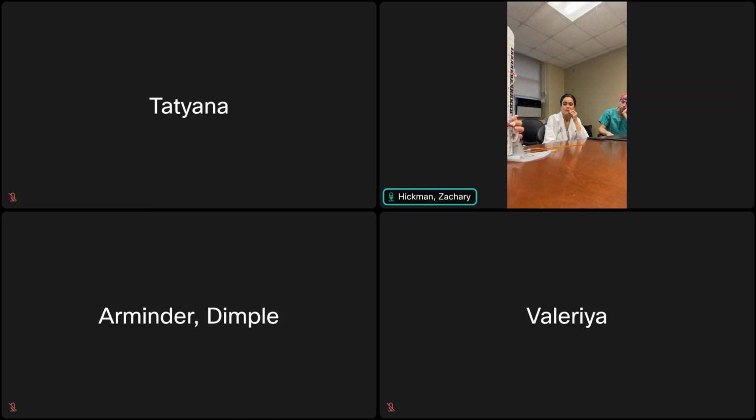So usually, I think you were talking about this last time, there are beds that have the pole that moves with the head, so you shouldn't have to adjust that. We don't have those, unfortunately. So once that's leveled up, you can open this so it's open to the pressure monitor. It'll be like that. And then you can press on the screen ICP 0.